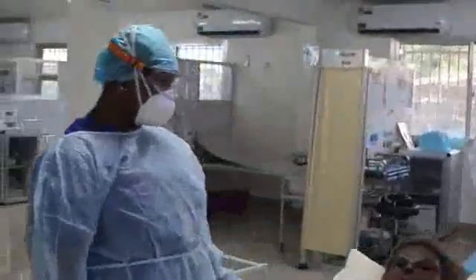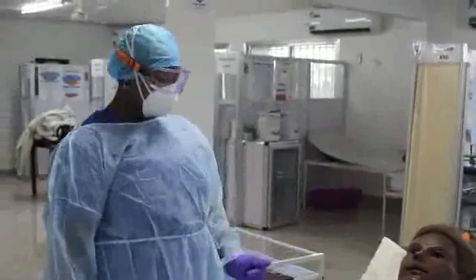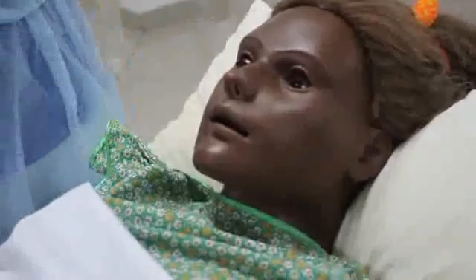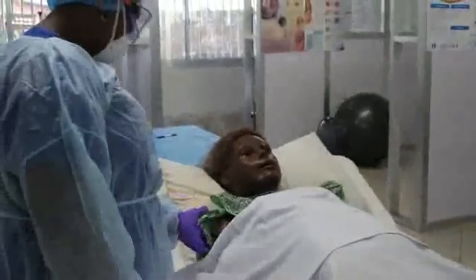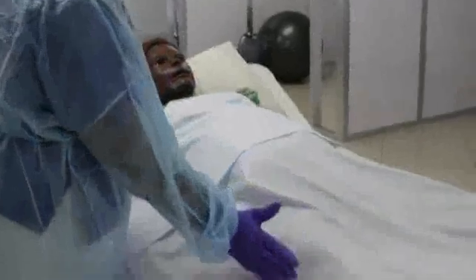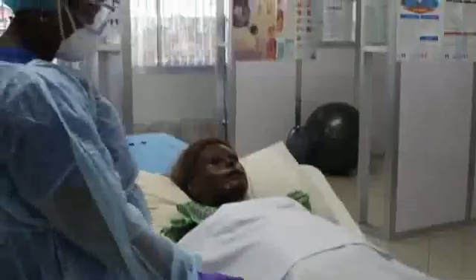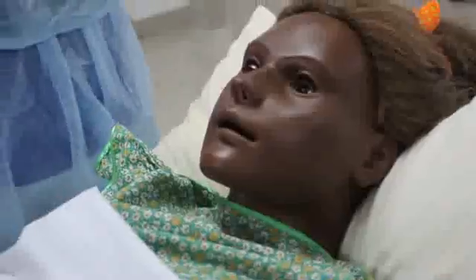Jessica, I'm here for the procedure which I informed you before. I'm going to give you injection morphine, but I have various sites to give. I want you to choose the one you prefer. I can either use the lateral aspect of the upper arm, or I can use the umbilical region, or I will use the thigh. So which one do you choose? Okay, since you choose the thigh, now I'm going to expose the thigh so that I can give you the injection. Excuse me.